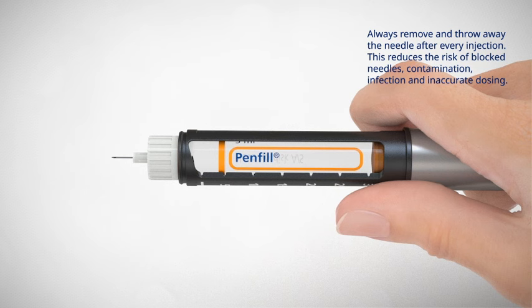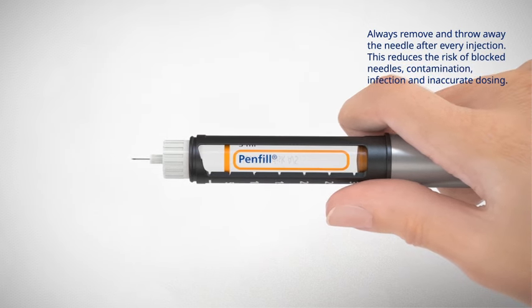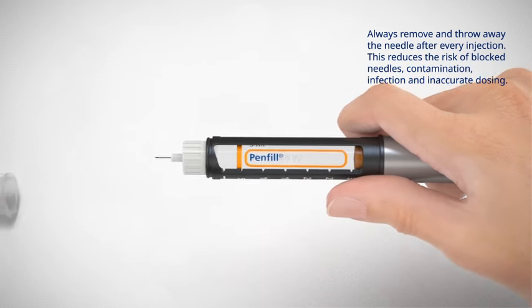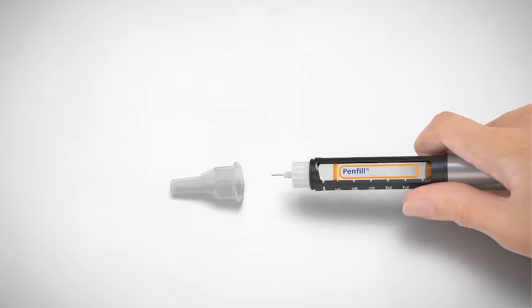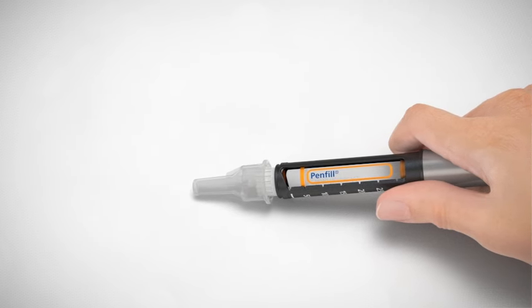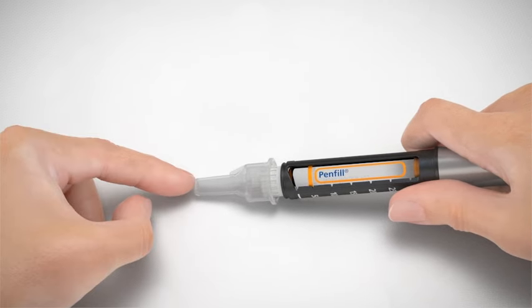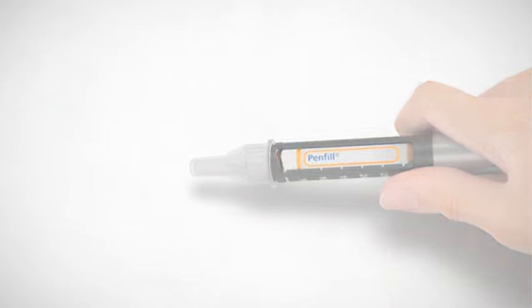Always remove and throw away the needle after every injection. This reduces the risk of blocked needles, contamination, infection, and inaccurate dosing. Lead the needle tip into the outer needle cap on a flat surface without touching the needle. Once the needle is covered, carefully push the outer needle cap completely on.